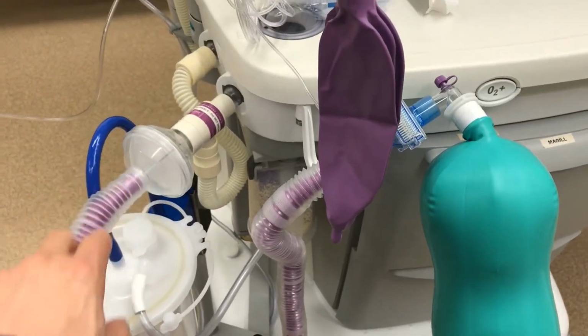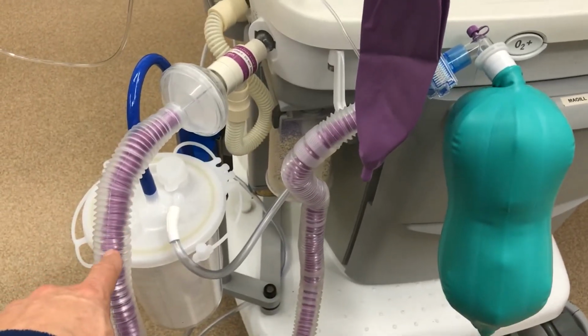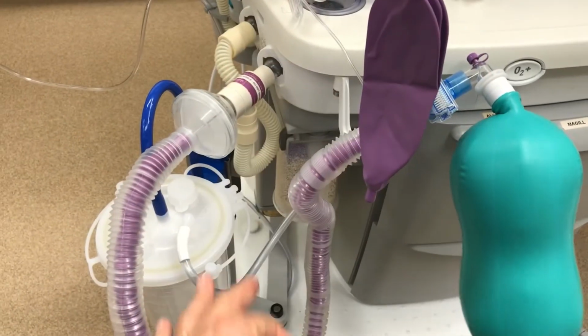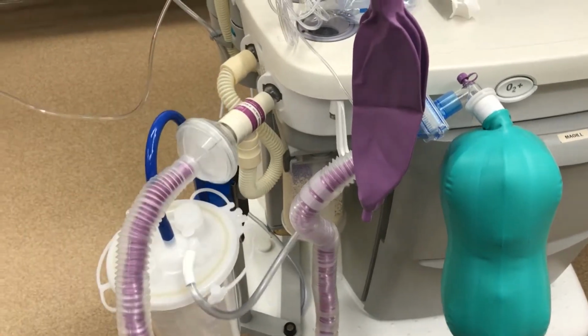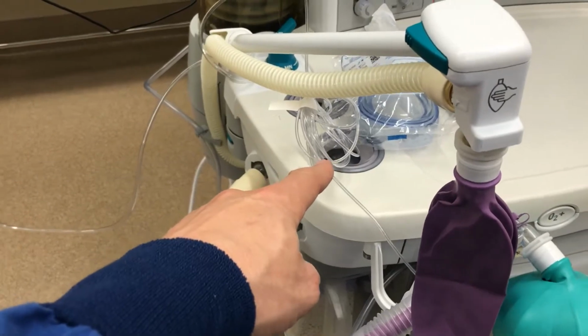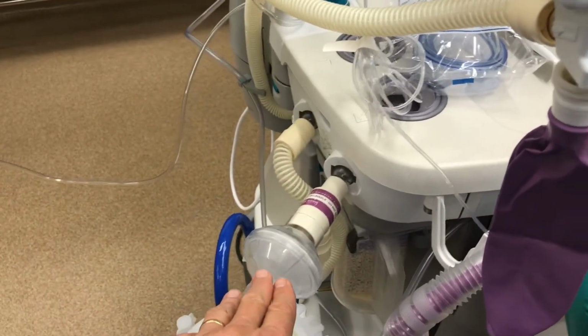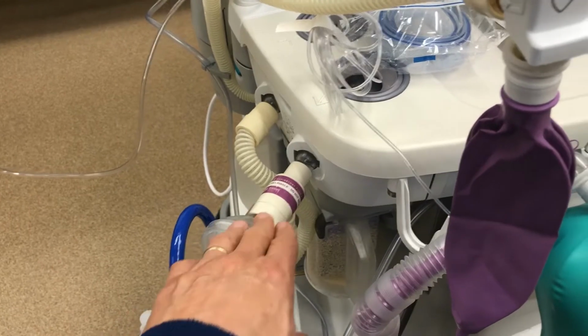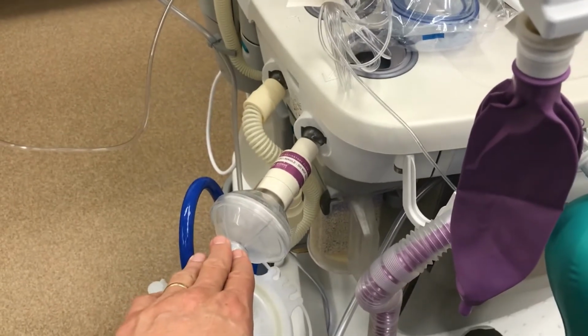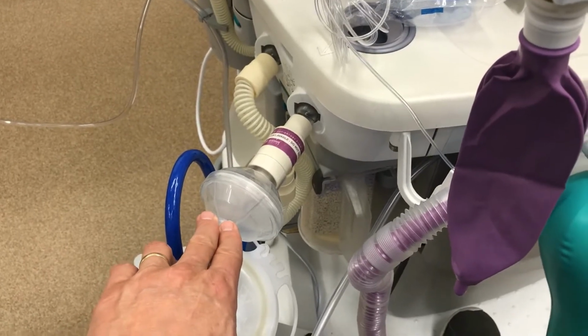These have a coaxial single limb design. The inspired air comes in through the purple hose. The expired air goes around the purple hose and the clear hose, and then hits this manifold to go out the expiratory valve and come in the inspiratory valve. This filter is on both limbs, and it's 99.999% efficiency for both viral and bacterial.